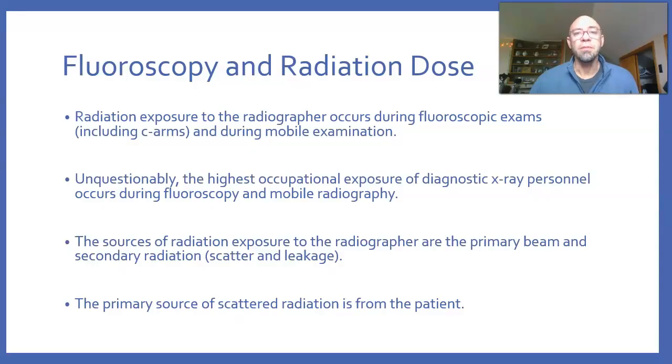It is true that you're going to be getting your highest amount of occupational exposure by doing fluoroscopy. However, I should note that you could also receive a high amount of dose by doing portables. So some of the things that we talk about in this lecture can also be applied when you're doing a mobile or portable exam.